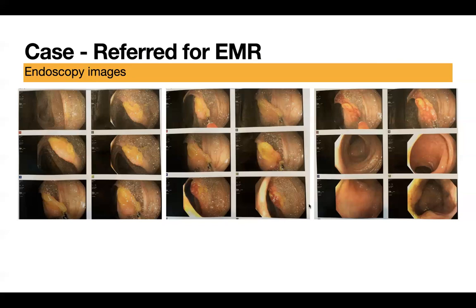Gas-X is simethicone, and I tell them to chew it after they take their first dose of the prep, and after the second dose of the prep 6 hours before. With that instruction, I see fewer and fewer bubbles that I have to wash and clear. So something to keep in mind.